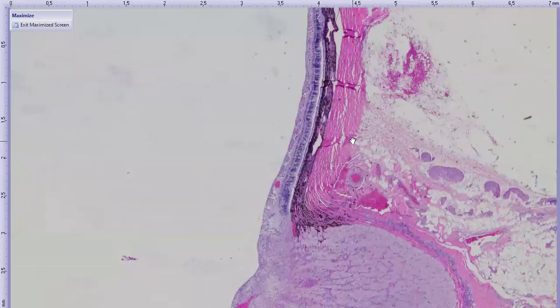That's because there's that delayed diffuse or segmental to diffuse degeneration of photoreceptors. We could see that. It could be that it's just too acute, or that the blunt trauma wasn't enough to cause severity of that. It's just a weird pattern to see.